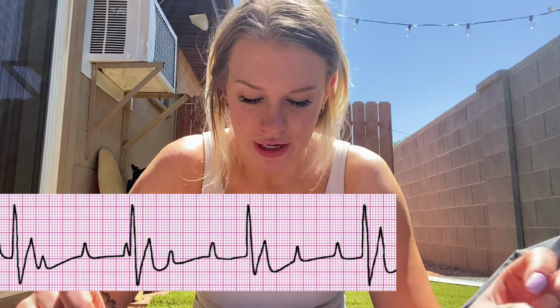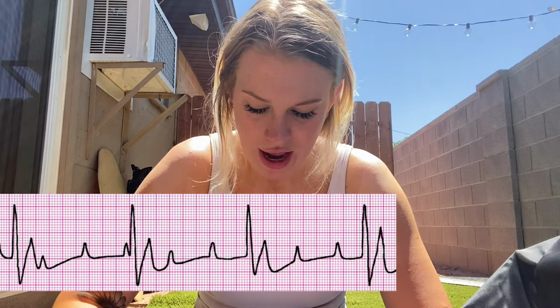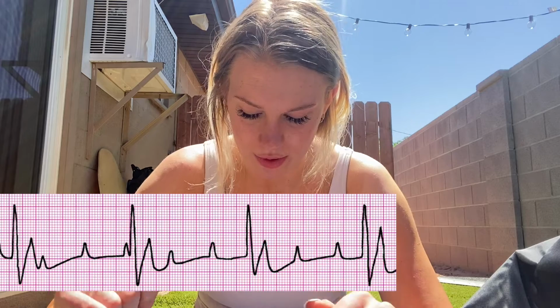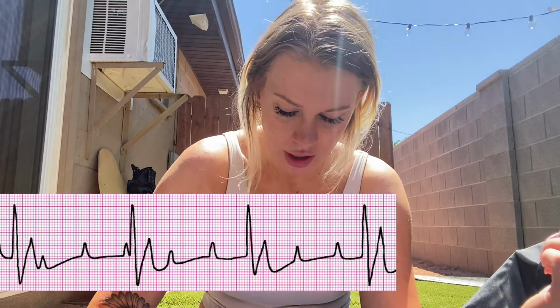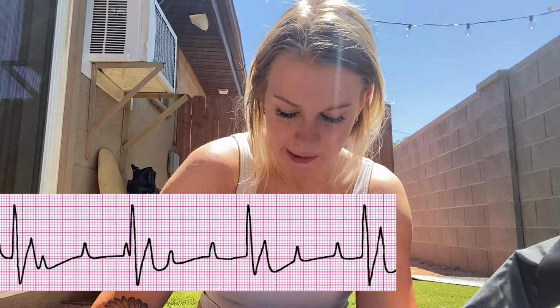And it can be with a ventricular or junctional escape, and no impulses get through from top to bottom. So there are going to be bizarre wide QRSs, because the QRS has its own pacemaker and is not following the sinus node. There are going to be some backup ventricular beats or junctional beats, depending on where the escape rhythm is coming from.